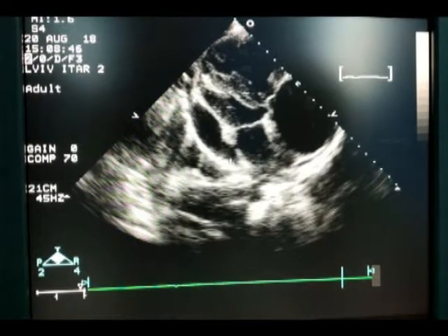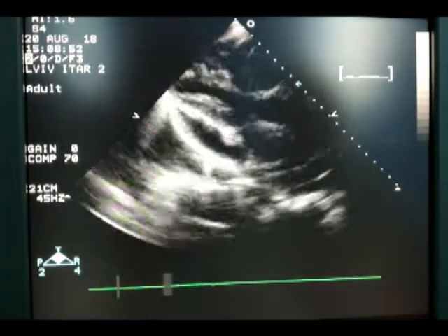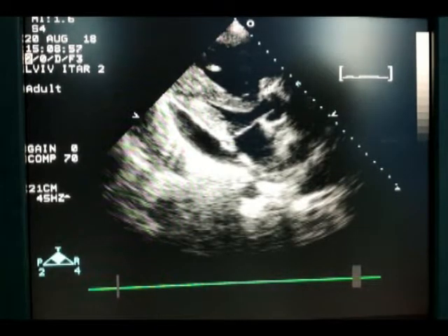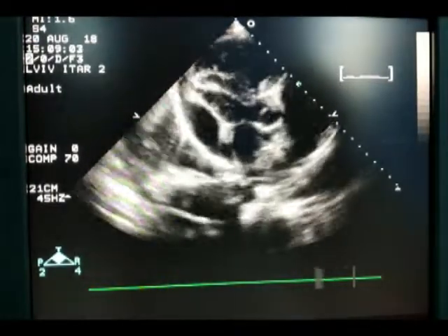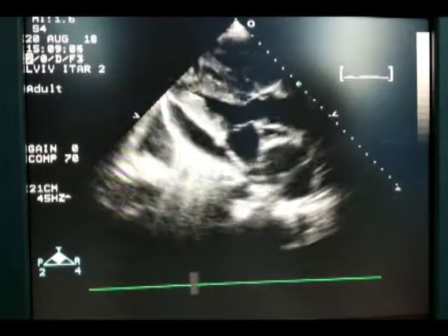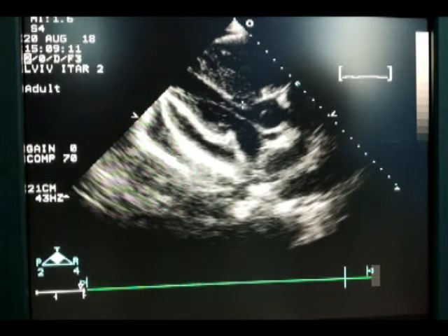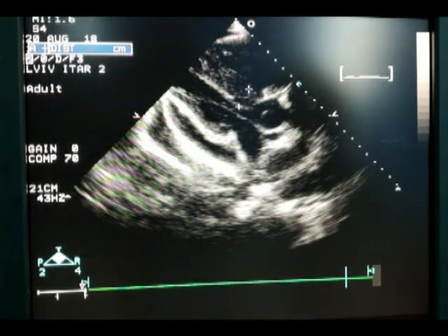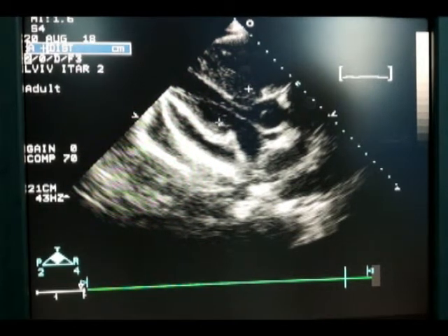Left atrium: 3.5 cm, normal size. Ascending aorta: 3.5 cm, normal size. Left ventricle: small cavity, 2.8 cm and 4.5 cm. The interventricular septum is hypertrophied at 1.7 cm. Posterior left ventricular wall 1.3 cm, also moderately hypertrophied.